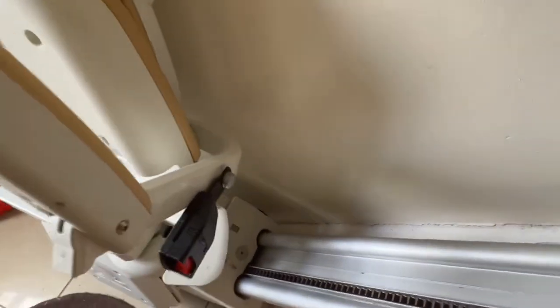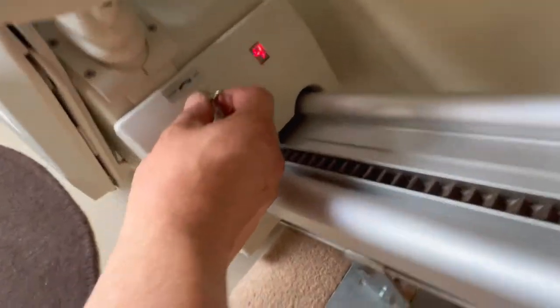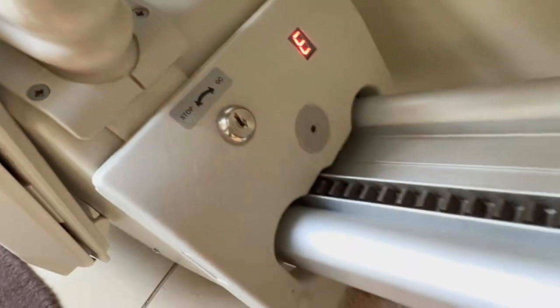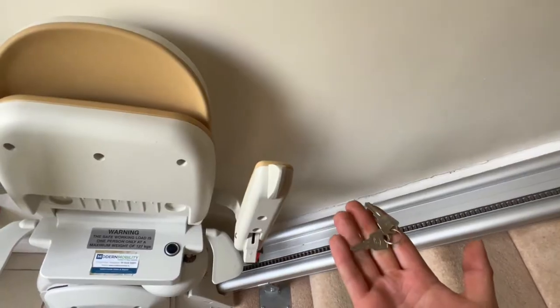If you want to prevent kids from accessing this stair lift, you can use this key. I'm going to switch the key off and take it out — now that stair lift will not move unless I have the key back in.